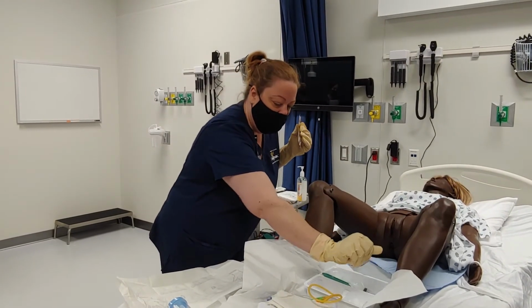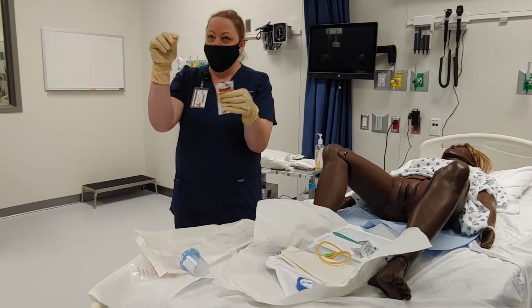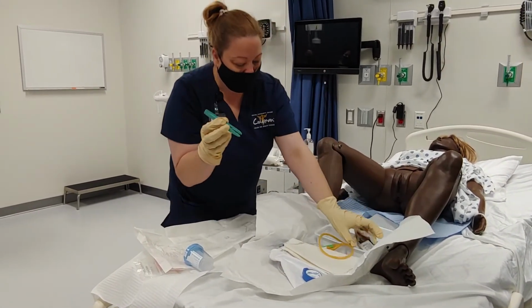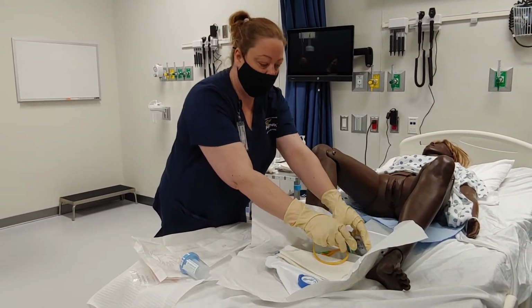I'll pour it on top of these cotton balls. If I have these, I don't have to use the cotton balls. I can just open it up and take each swab out, okay? And it has the iodine on it. So according to which one you use, if I'm using the cotton balls, I will need to have a pair of forceps to be able to pick up each of the cotton balls to do the cleaning with.